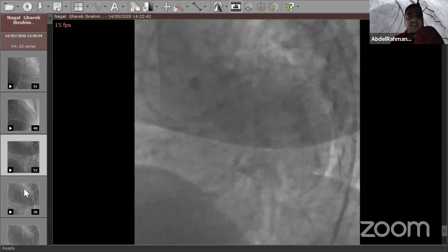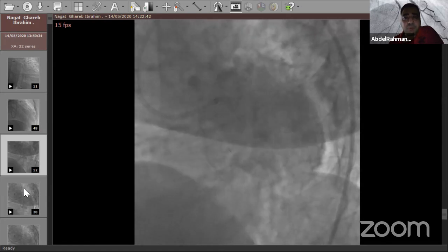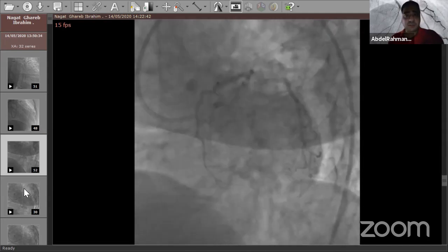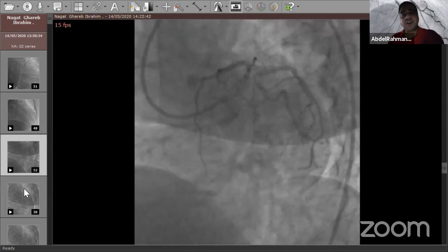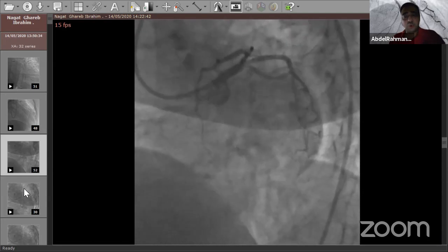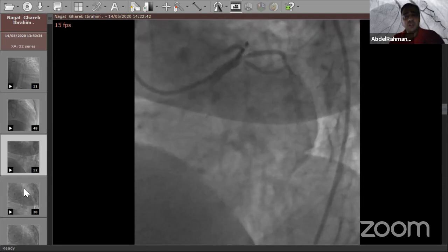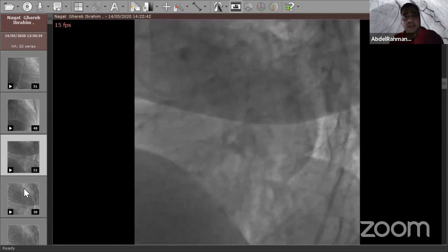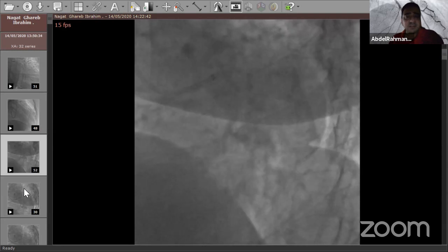But we had a significant proximal LAD lesion and a haziness in the ostia of both side branches here, the ramus and the LCX. So I decided to do a trifurcation with two guiding catheters, what's called the ping-pong technique, because I believe that I will for sure do triple kissing balloon inflations in such a case. And I wouldn't truly expect what would happen with this patient.